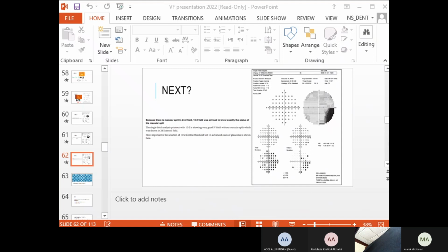Anybody can help? I think Khan maybe he's the one who can. Yes. So describe what you see. This is a visual field. A patient will not come to you and say, I have glaucoma, right? A visual field. It's already confirmed that the test is reliable. Is it nasal? Yes.